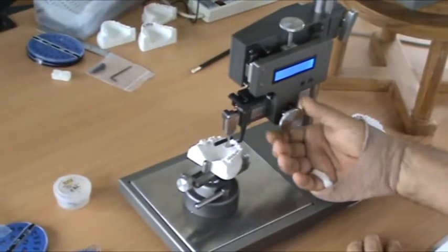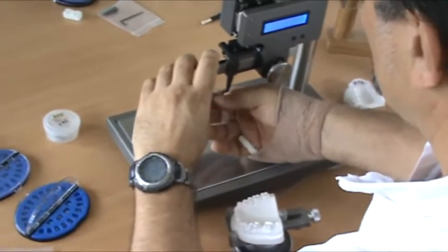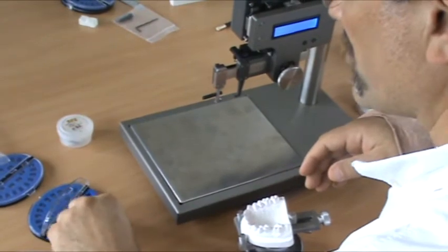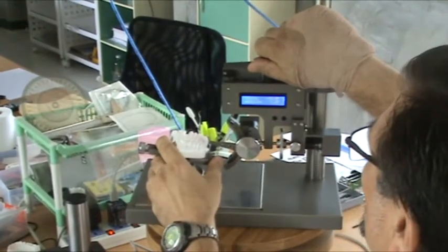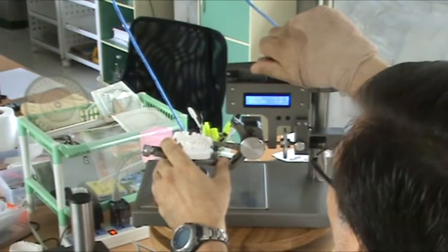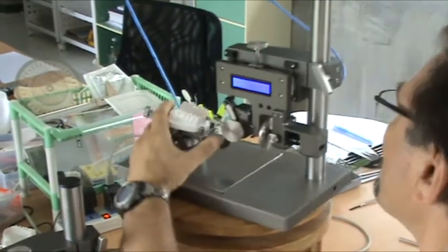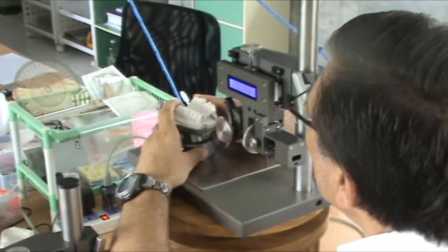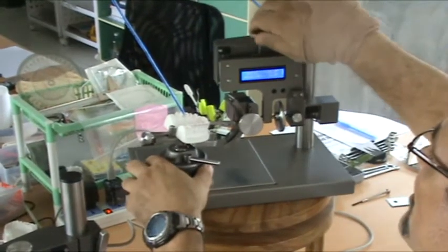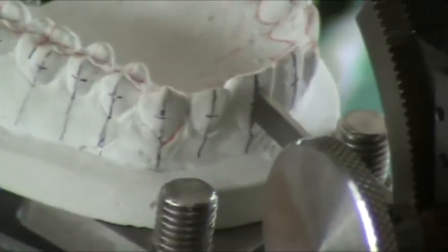So you can use it for lingual orthodontics, in which case thickness is very important. You can turn it around and use it for labial orthodontics, so for labial bonding, and move the tooth to the blade. Tip. Check the top. Check the height, the tip, fit, everything fit. And we lock the base.